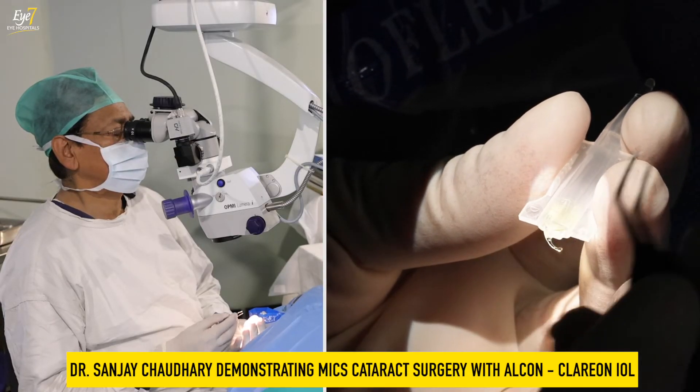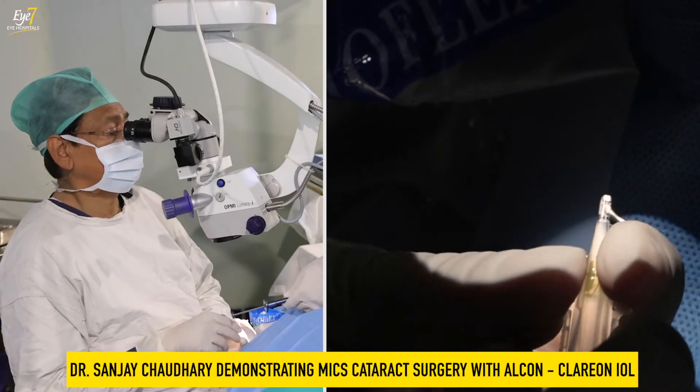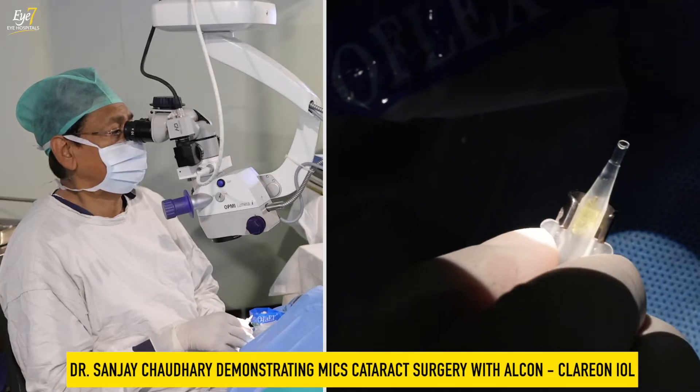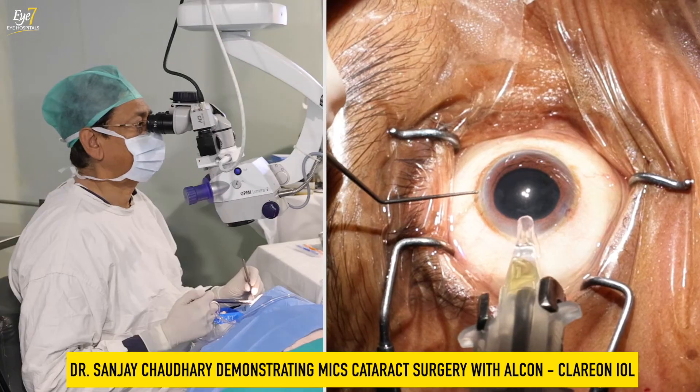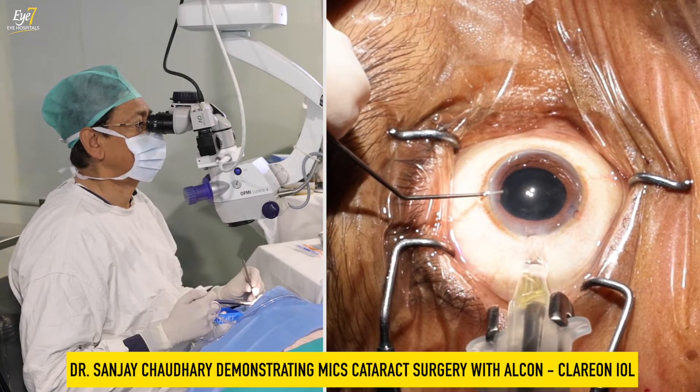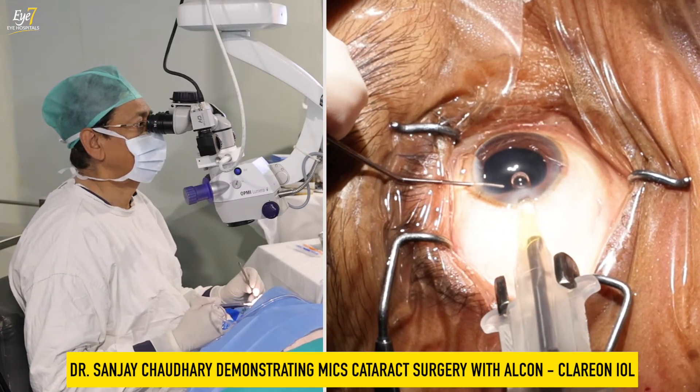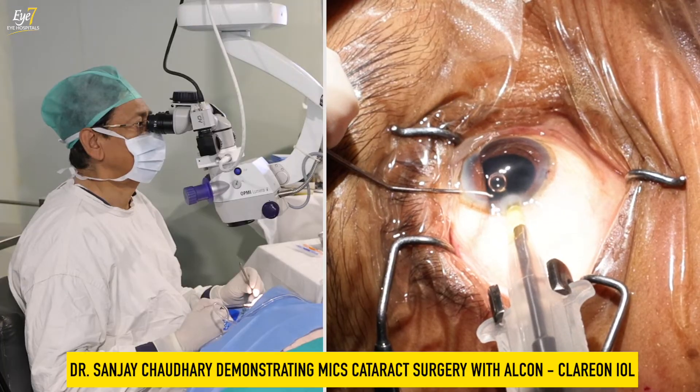Loading the lens now — this is a very soft lens, even softer than the previous version which was the AcrySof series. We'll see how smoothly it goes through a 2.2 millimeter insertion.